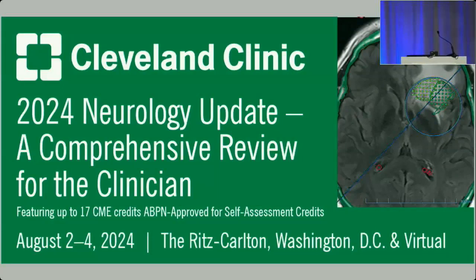Now, as you lighten up the anesthesia, the patient may come back with EEG evidence for persistent status. So the clinical management is to leave the person in burst suppression for some period of time, and then lighten up the anesthesia to see if the status has resolved, and they go back into a normal state. So a lot of it is usually at the bedside and clinical in terms of burst suppression.